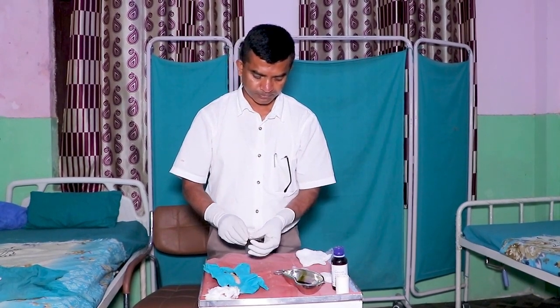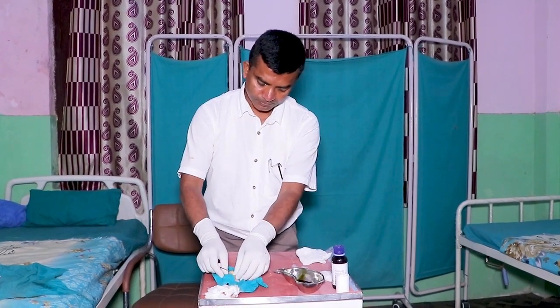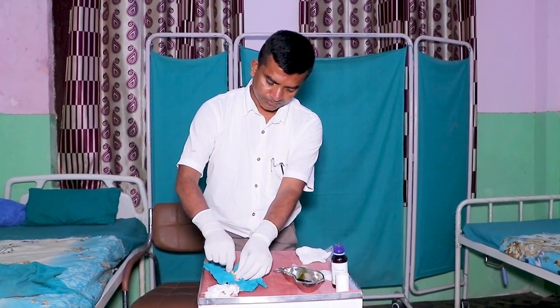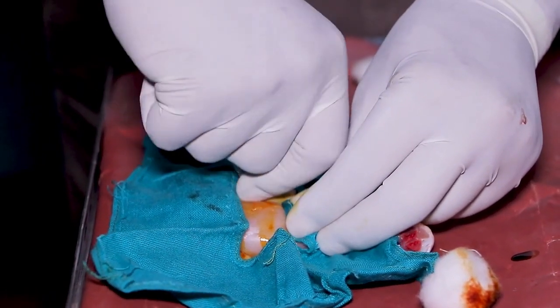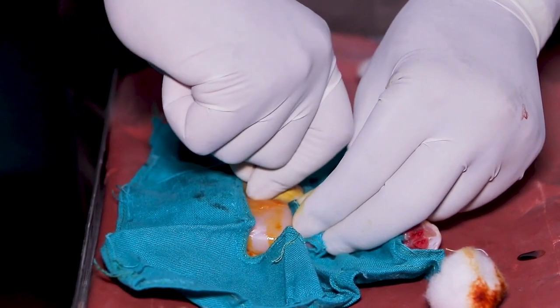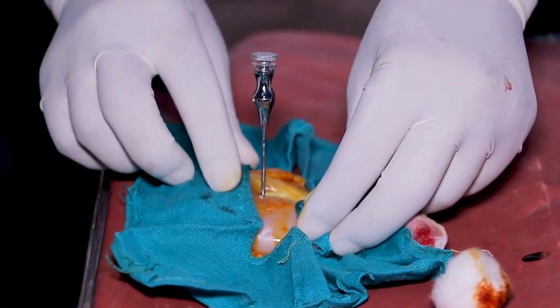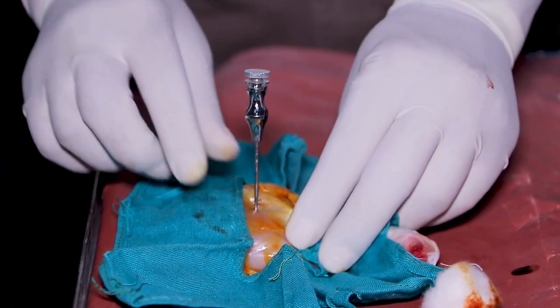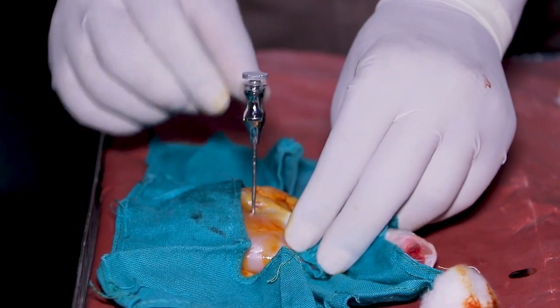Hold the needle in the palm of the dominant hand and position it at a 90-degree angle to the long axis of the bone. Advance the needle through the bony cortex with a twisting and rotating motion, maintaining a steady pressure. A sudden loss of resistance indicates that the needle has penetrated the cortex and reached the medullary cavity.